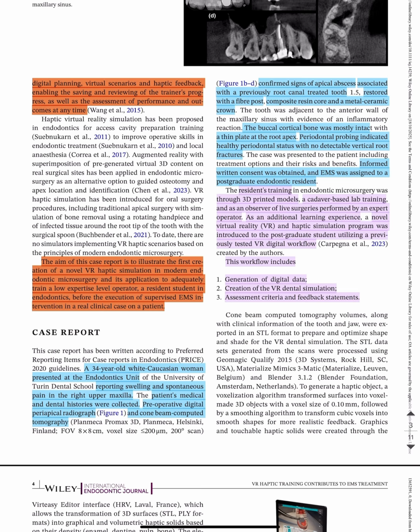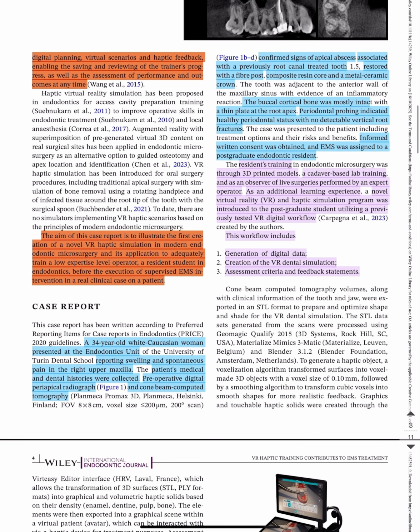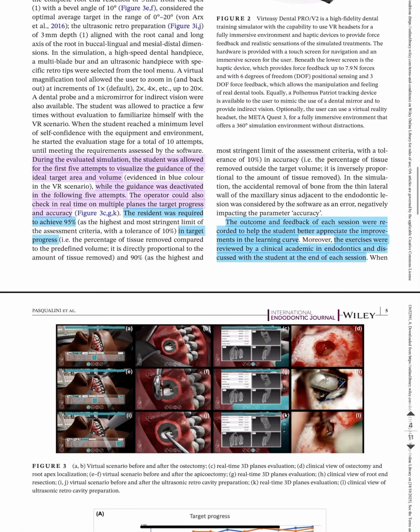As an additional learning experience, a novel VR and haptic simulation program was introduced to the postgraduate student, utilizing a previously tested VR digital workflow, which includes generation of digital data, creation of a VR dental simulation, and the assessment criteria and feedback statements. During the evaluated simulation, the student was allowed, for the first 5 attempts, to visualize the guidance of the ideal targeted area and volume, while the guidance was deactivated in the following 5 attempts.